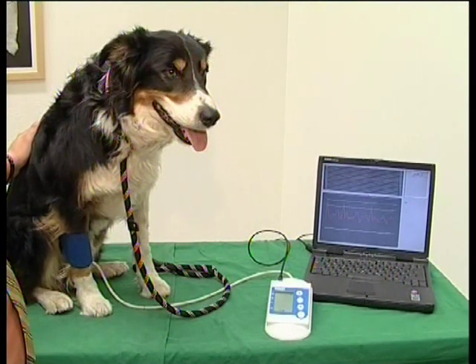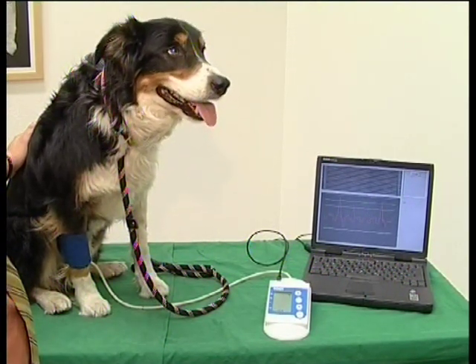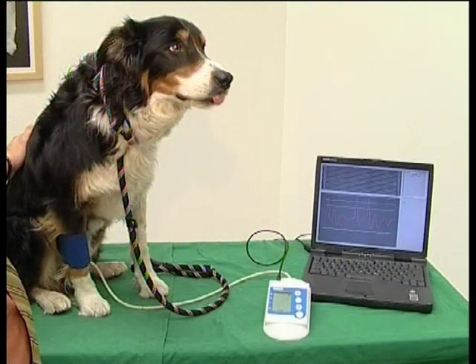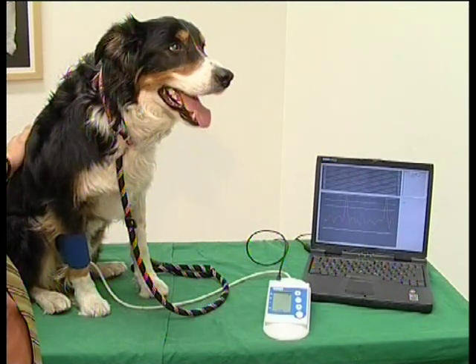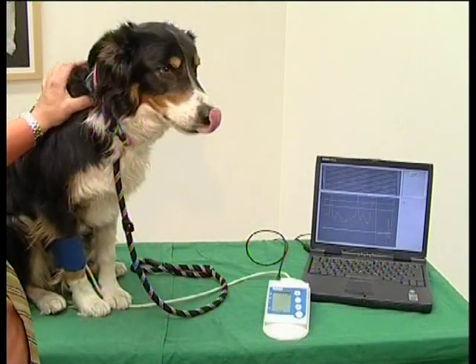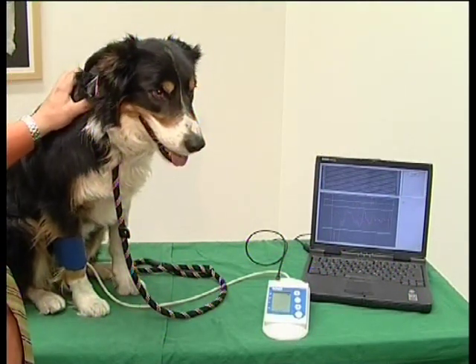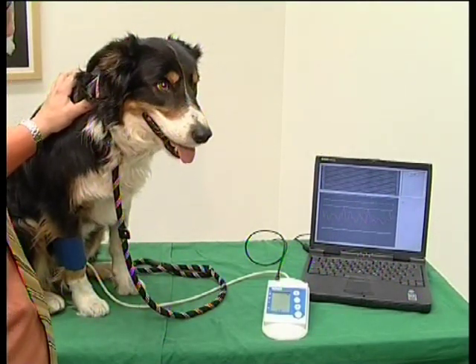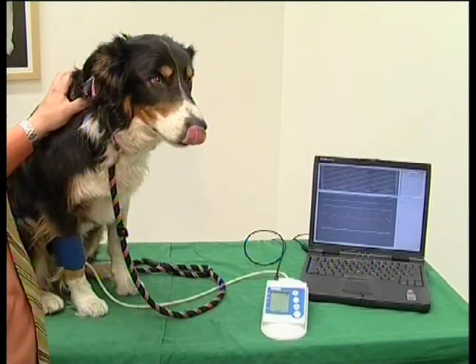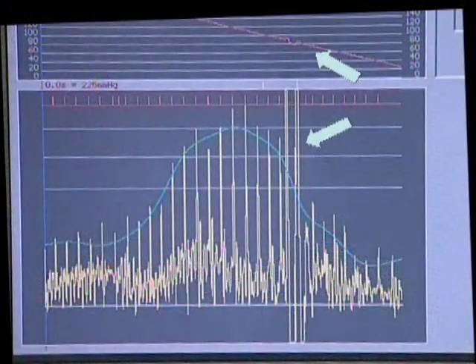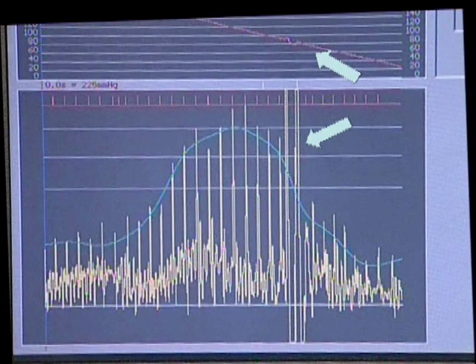The increased respiratory rate and effort does not influence the measurement. Shifting weight from the left to the right limb causes artifacts which could be seen during this measurement and are displayed in the final graph as well. The artifact is also visible on the linearity curve. The blood pressure measurement is not influenced by these artifacts, as the electronic valve regulation of the HDO ensures a return to linearity and thus an immediate cut-off of the artifact. Note: this is not an extreme example of movement artifacts.